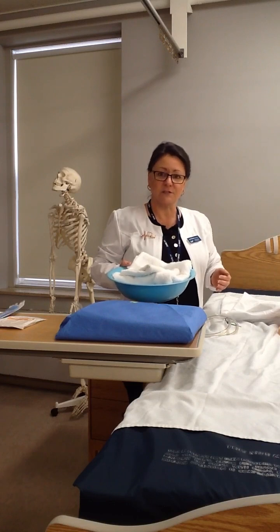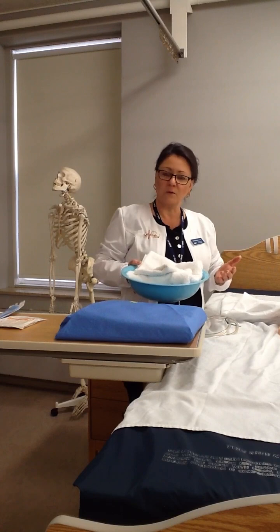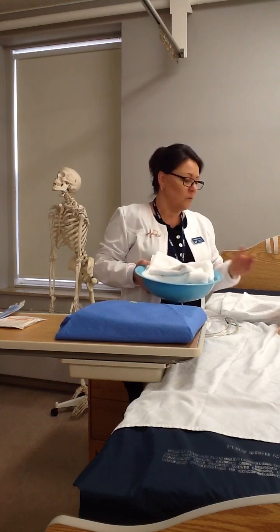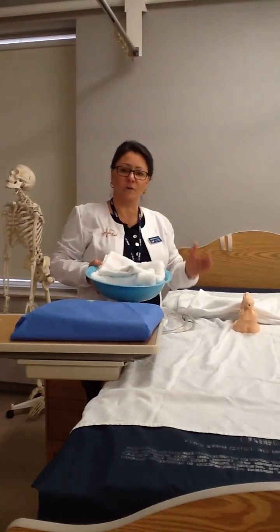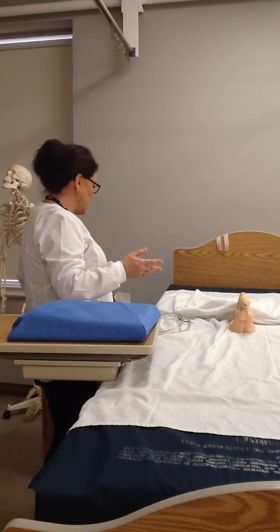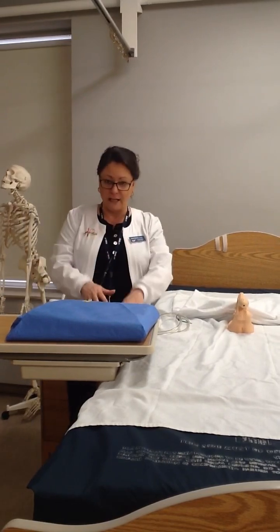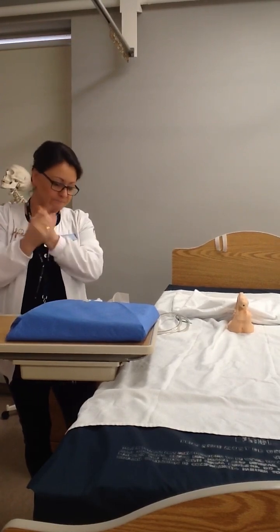That reduces the risk for infection when we're inserting a catheter. So we always wash, bring a nice bowl of warm water, some soap, wash, rinse, and dry the genitalia really well before you begin your procedure. So once I've done that, I can put that behind me. I can take off my gloves, and I'm going to perform hand hygiene as soon as I remove my gloves.